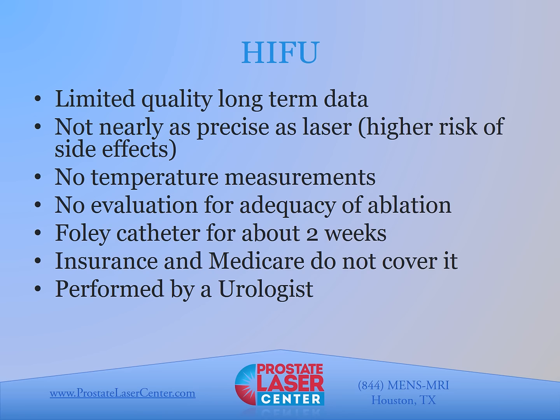A Foley catheter does need to stay in for about 2 weeks after the procedure, although there are some practitioners who insist that every patient undergo a TURP prior to HIFU. Those patients don't need a Foley after the HIFU treatment. Insurance and Medicare also do not cover it, similar to focal laser ablation. And the HIFU in the vast majority of cases is performed by a urologist, as opposed to somebody like me who's an interventional radiologist.